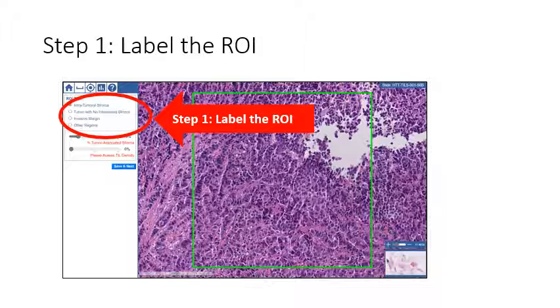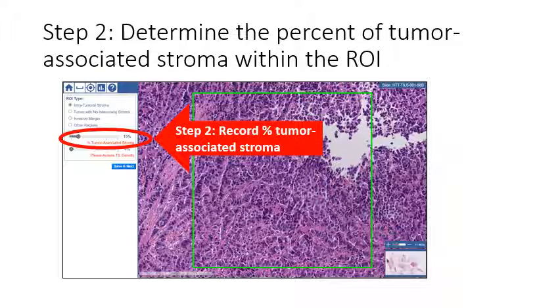The first step for your annotation is to select a label for the ROI. Then, in the second step, determine and record the percent of tumor-associated stroma that is within the ROI. In other words, how much of the region of interest is tumor-associated stroma, where the denominator is the area of the ROI. You may use the mouse and slider bar or click on the number and edit with your keyboard.